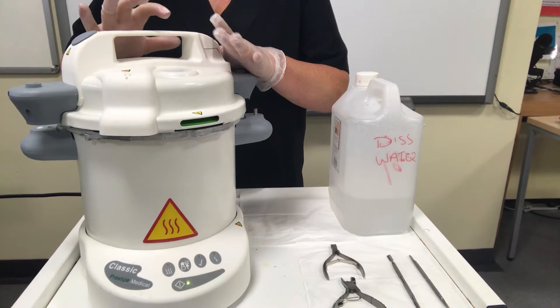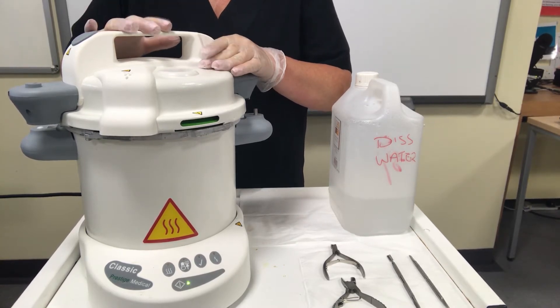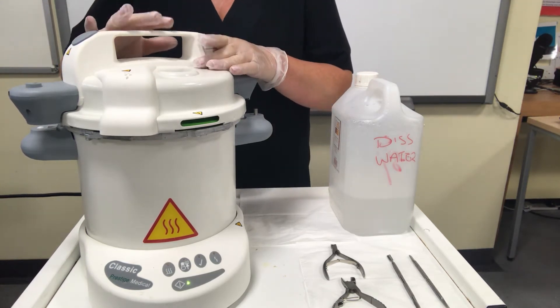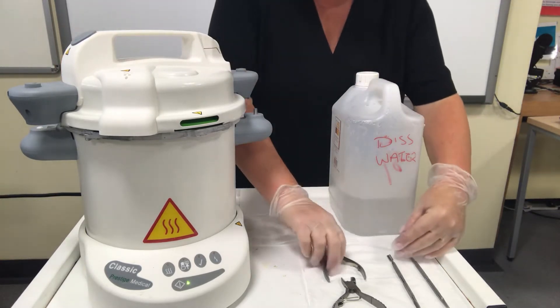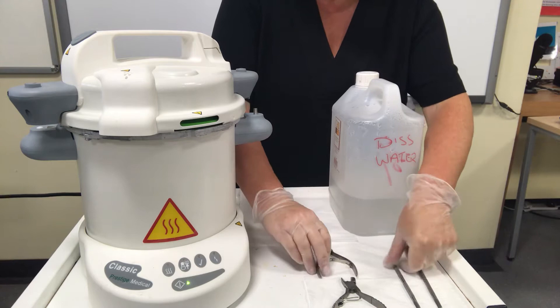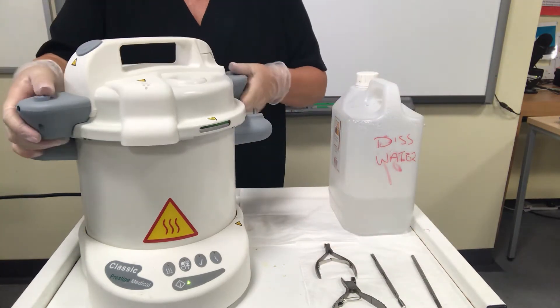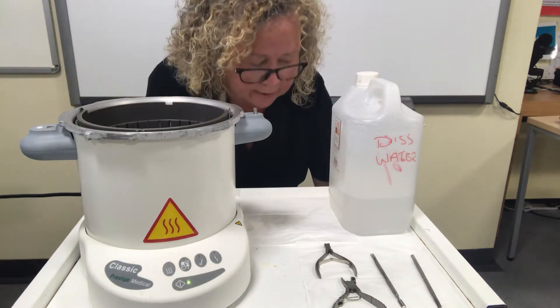There are some plastics that you can put into it but you need to check to see that they're autoclave safe, because if you do put plastic in here it will melt. So it is primarily for metal tools. We've got some manicure and pedicure tools to pop in.